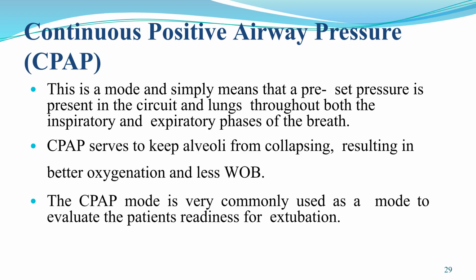Continuous positive airway pressure, or CPAP, is a mode where a preset pressure is present throughout both the inspiratory and expiratory phases. CPAP prevents alveoli collapse, improving oxygenation and reducing the work of breathing. It is commonly used to evaluate readiness for extubation.